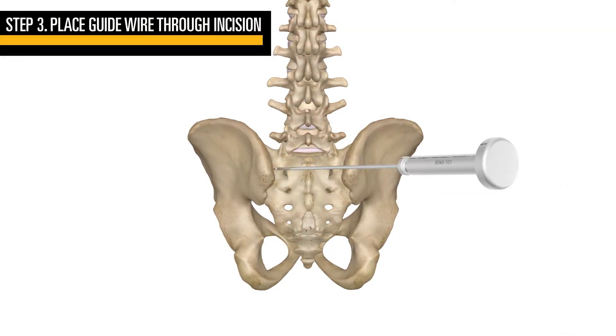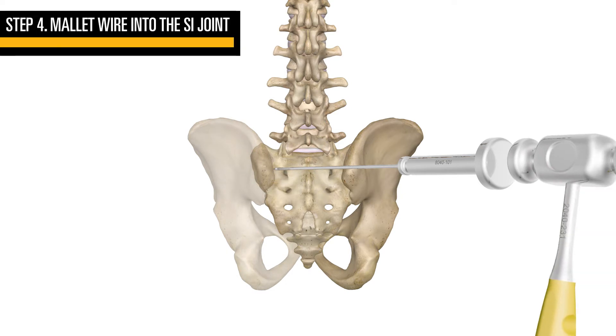Place the stackable guide wire down into the midline incision towards the direction of the superior marked circle. The medial lateral angle of the first pin will be approximately 30 to 40 degrees towards the superior. Mallet the guide wire using the strike cap and supplied mallet.